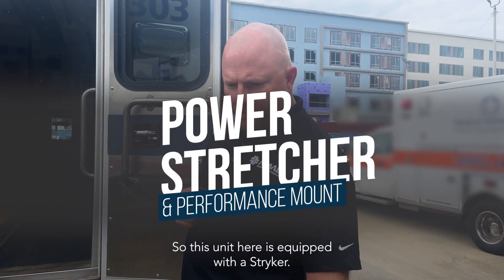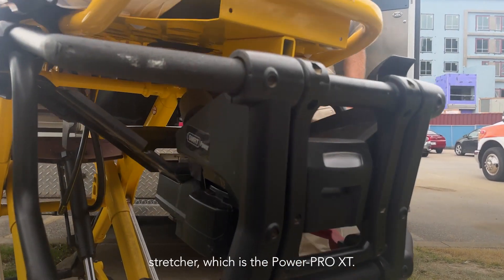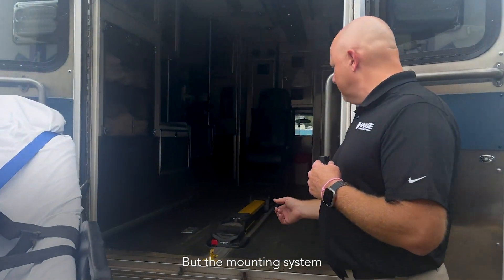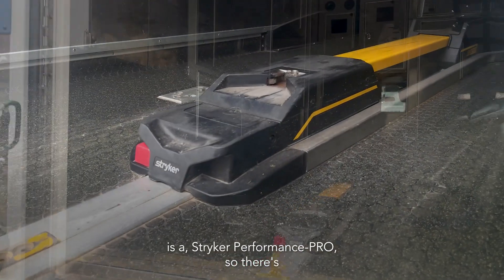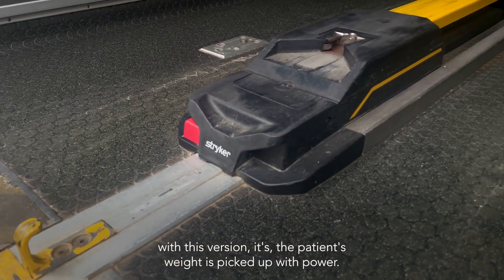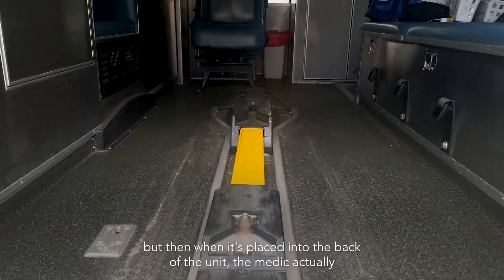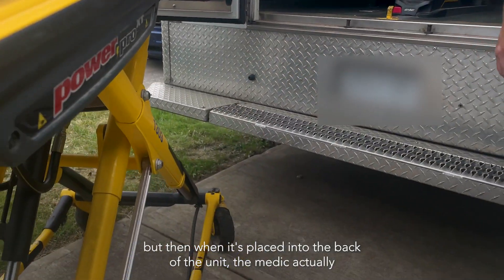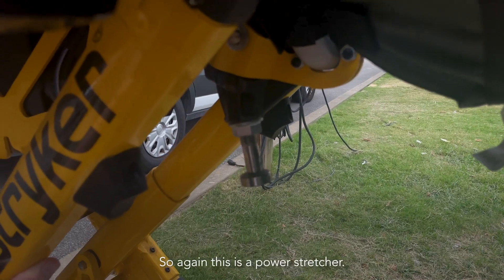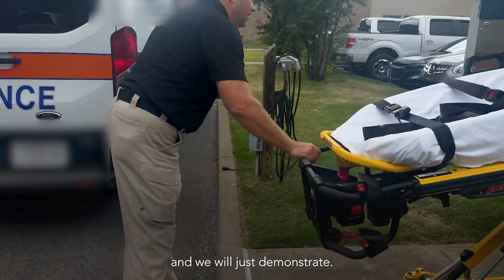This unit is equipped with a Stryker 6506 PowerPro XT, but the mounting system is a Stryker Performance Pro. So there's no power assist with this version for loading. The patient's weight is picked up with power, but when it's placed into the back of the unit, the medic actually picks up on the handle and has the patient's weight. This is a power stretcher, and we will demonstrate.